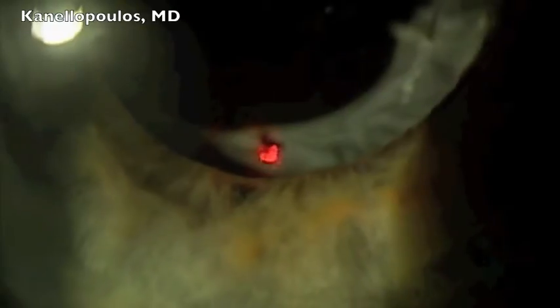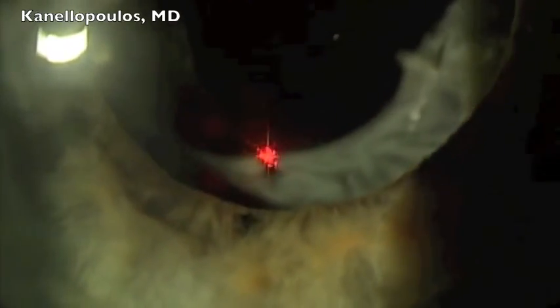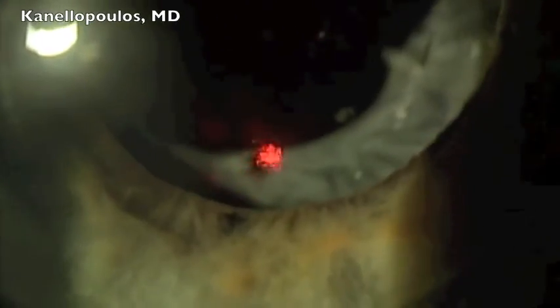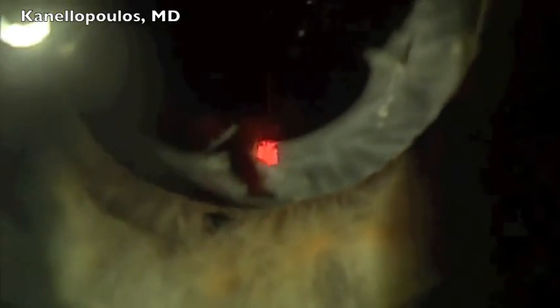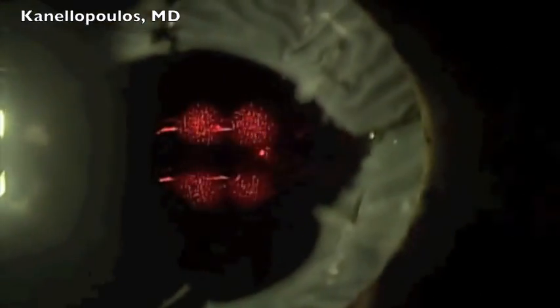Going down to the 6 o'clock position here — you can see I have a few shots in early in the procedure. This only takes 3 minutes and is done under a drop of topical anesthesia. We usually finish with a drop of iopidine or alphagan, measure pressure half an hour later, and of course a thorough peripheral retina exam a month later, to make sure the YAG doesn't create any peripheral retina tears.